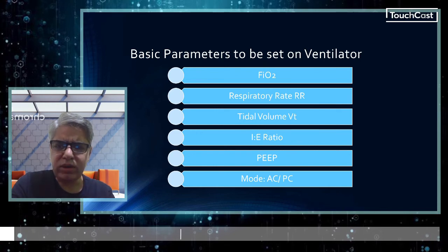I would talk about these modes in detail in my next lecture, but for the sake of simplicity, let me just tell you, if you start with intubation, definitely you give a general anesthetic to the child, he's completely knocked out, you put him in deep sedation, you have used some form of paralysis, so this child cannot breathe on his own. So the machine has to take over.